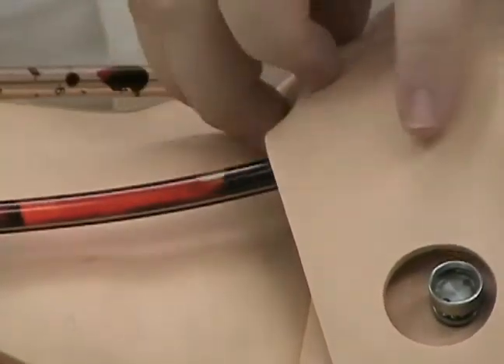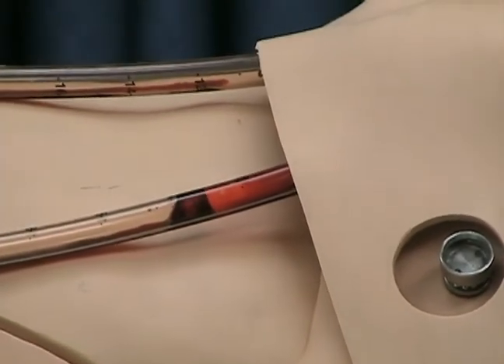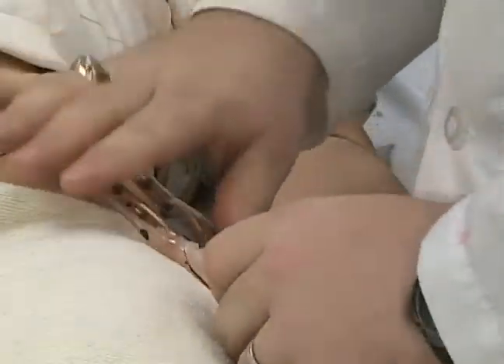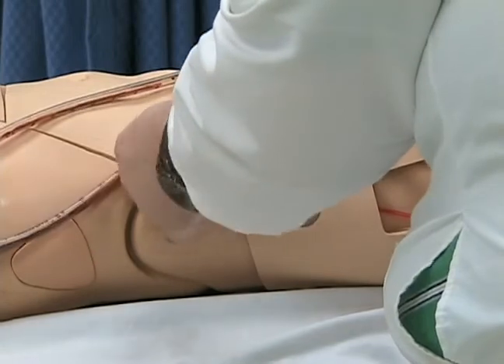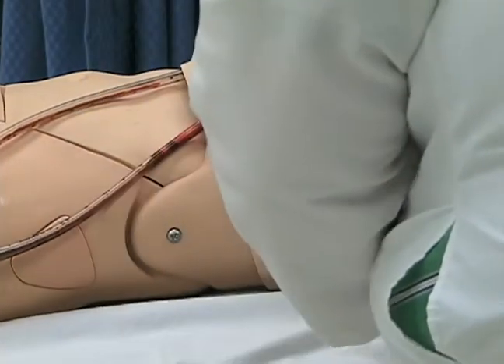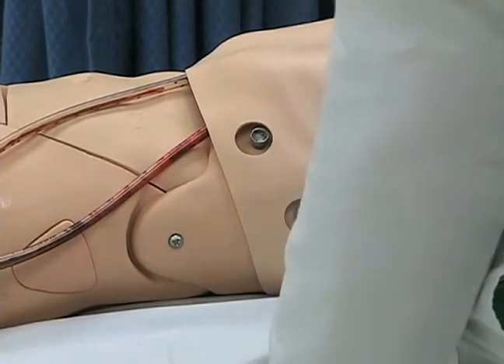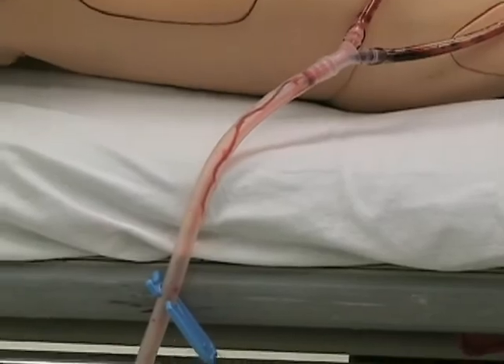We tuck the clotted chest tube under, and the unclotted one. This will further be moulaged with an abdominal pad and some tape. Attach the ends of the chest tube to the Y connector on your Pleurovac. As you see, the clot has been manipulated. The confederate opens the roller clamp, and now the chest tube can flow with blood. It flows through the chest tube, down the tubing, and into the Pleurovac.